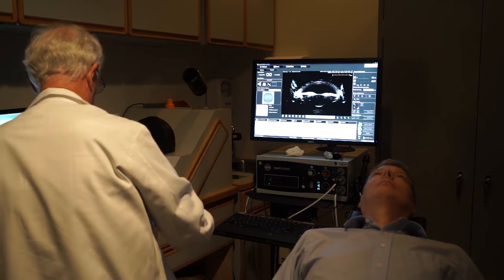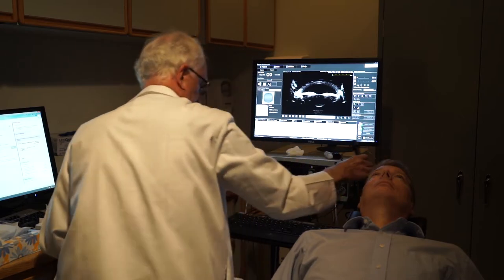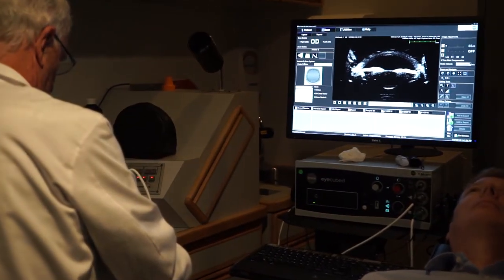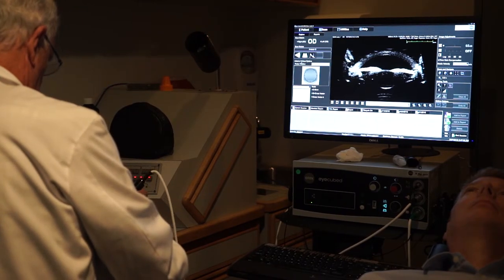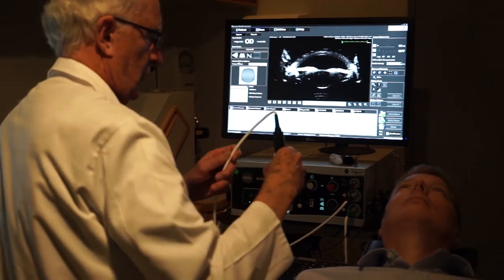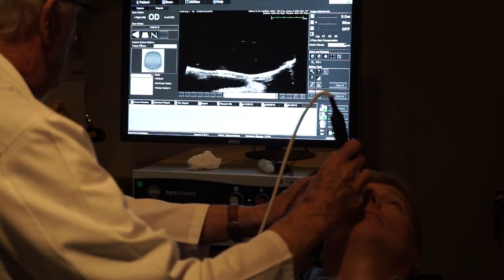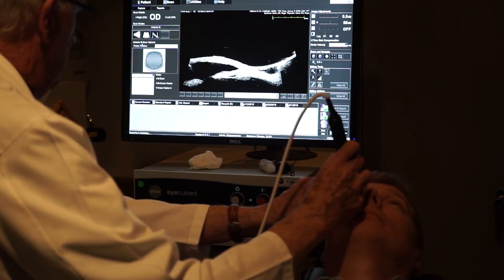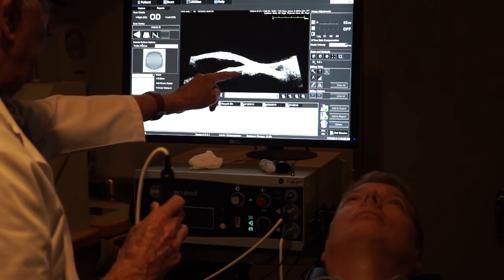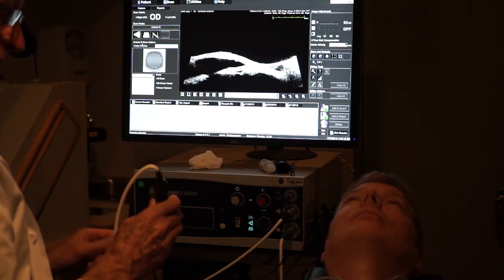You fill the bubble cover full of water, then put your probe right into it. You need to get a tight seal, and if you get any bubbles it can foul up your picture, so you want to minimize bubbles. Then you go right to the eye directly and can see the structures — the ciliary body, the cornea, the iris — it's another way to do it without having to use the shell.